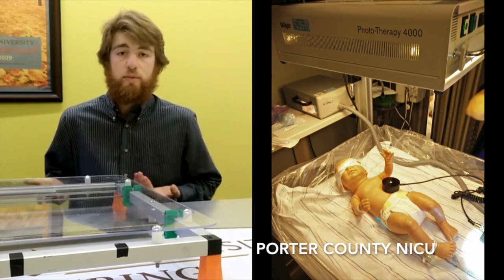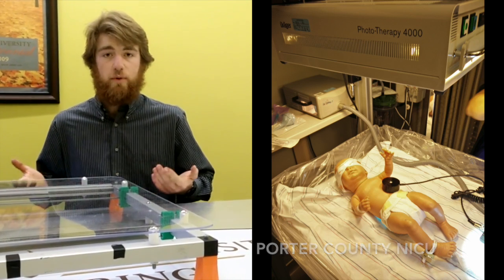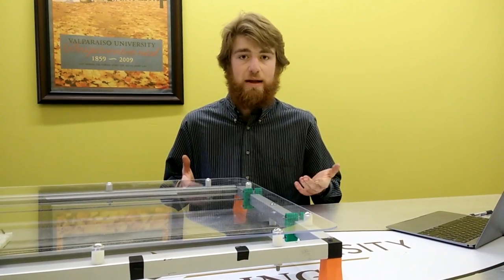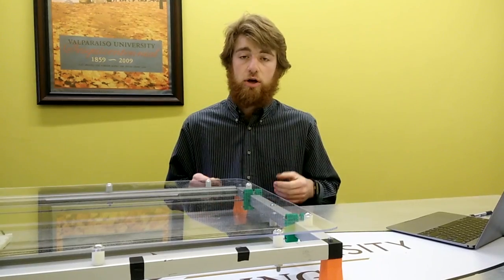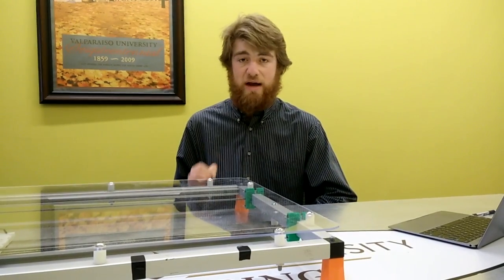Currently, light is only prescribed on a 1, 2, 3, 4 lights, floodlight, spotlight basis. Very inconsistent. Therefore, for our project, our goal was to quantify the exact amount of light energy hitting an infant during phototherapy.